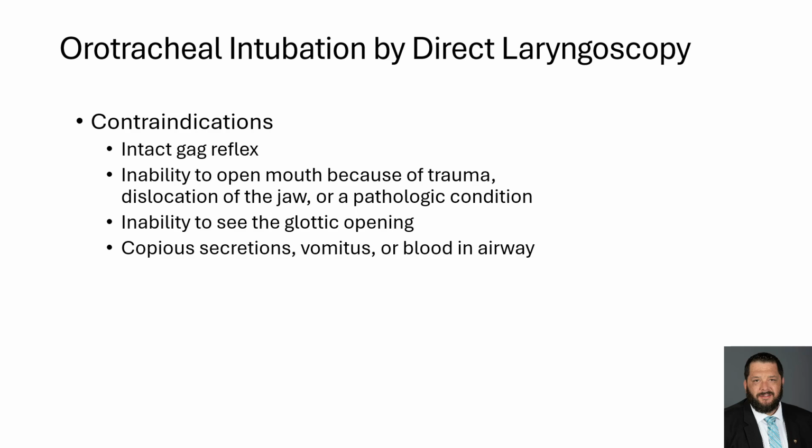These are high acuity, low frequency skills that we perform as paramedics, and you should practice them often, not only in the laboratory setting while you're in school, but practice them frequently once you're out of school and in the field. It's not uncommon for paramedics to go 6 months or a year without having to intubate a patient, and you don't want the first time that you've intubated a mannequin or practiced this skill to be in a critical patient that needs your intervention for survival.